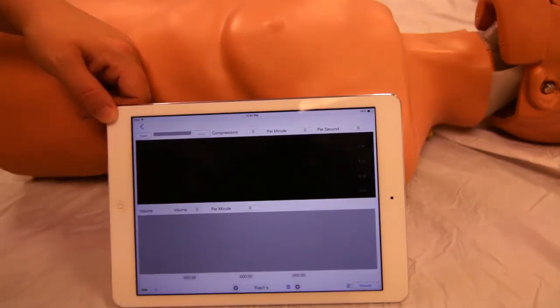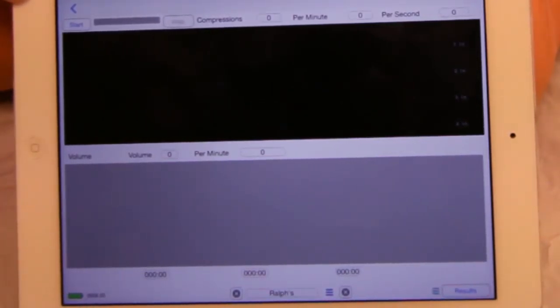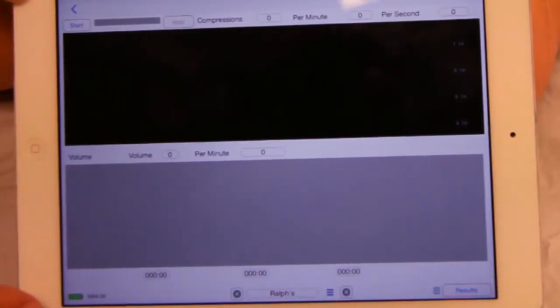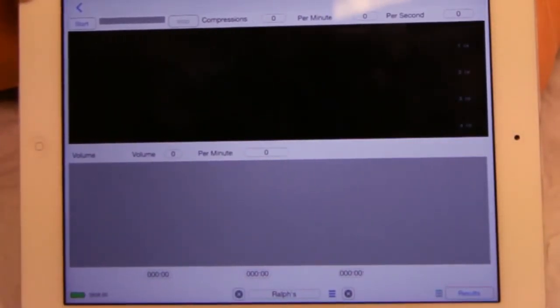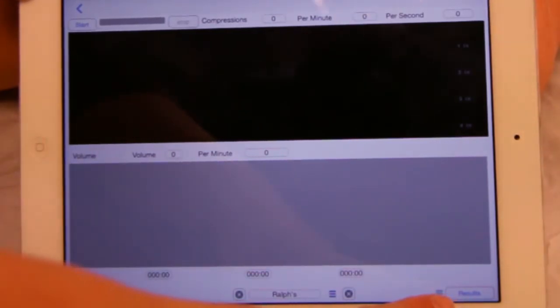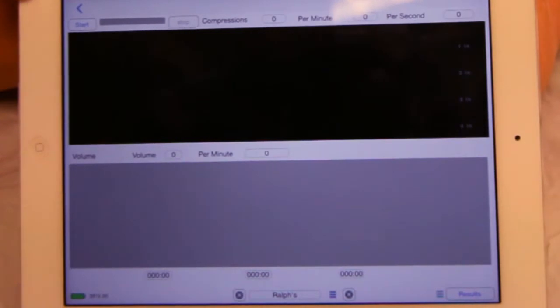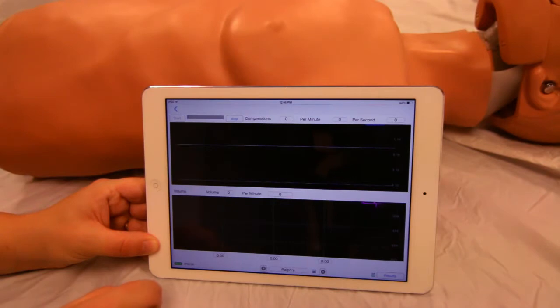Features of the control screen include start and stop buttons, a box for compressions, and a box for ventilations. Note that 'N/A' will appear if testing for compressions only, along with the battery charge level. When start is tapped, note graphs appear and the time bar changes in color.